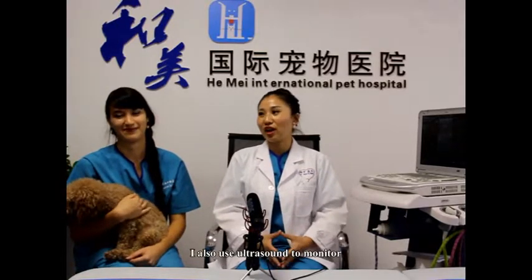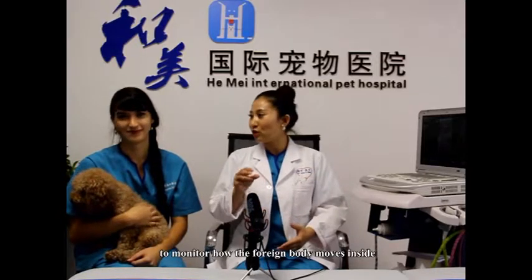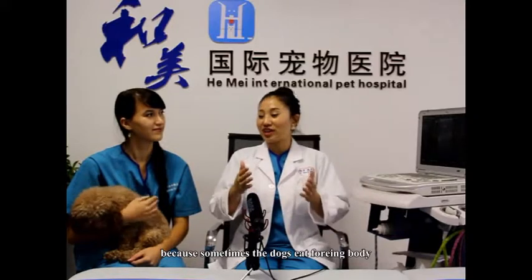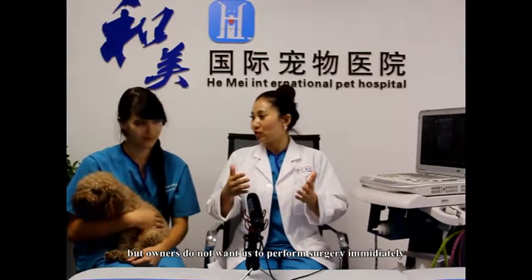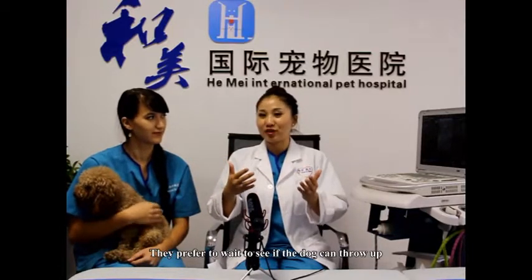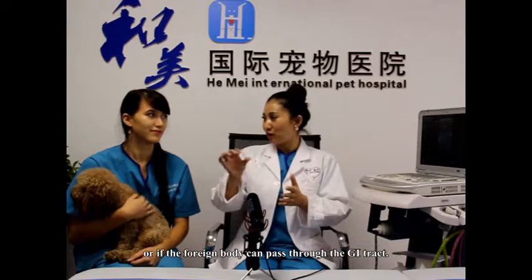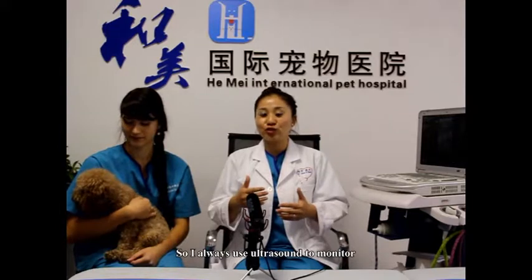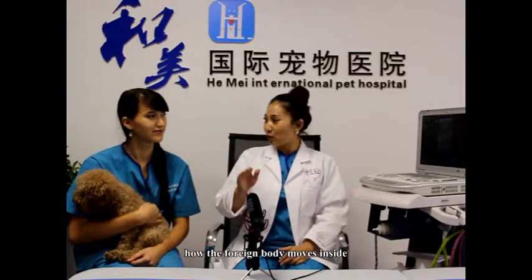Yeah, that's true. I also use ultrasound to monitor how a foreign body moves inside, because sometimes the dog eats a foreign body, but the owner does not want us to perform surgery immediately. They prefer to wait to see if the dog can throw up, or the foreign body can pass through the GI tract. So I always use ultrasound to monitor how it moves inside.